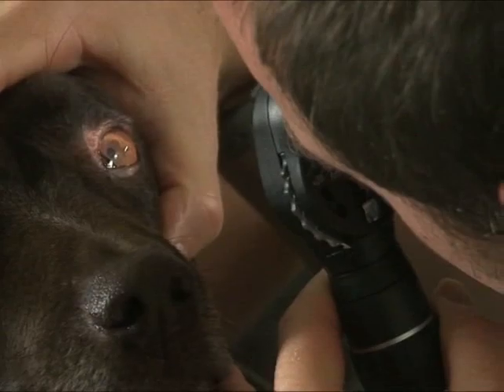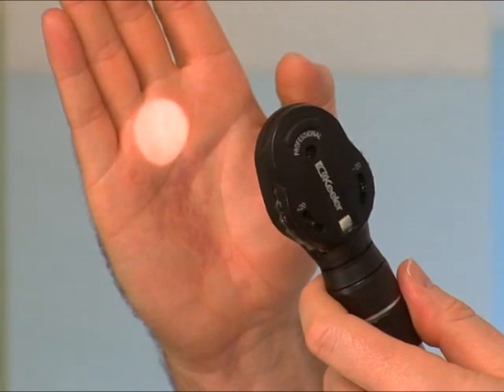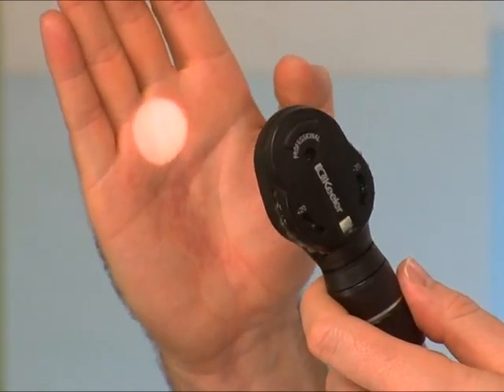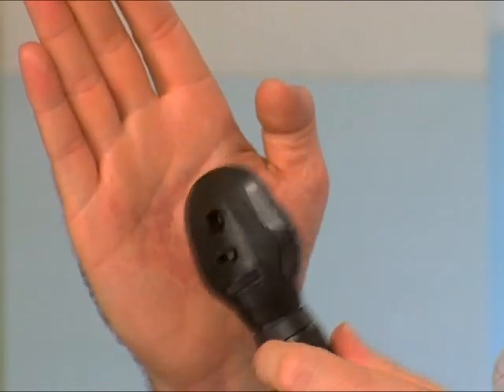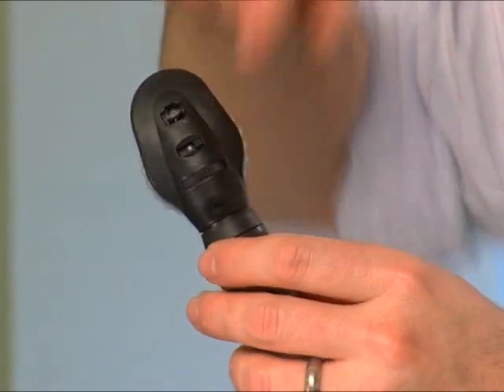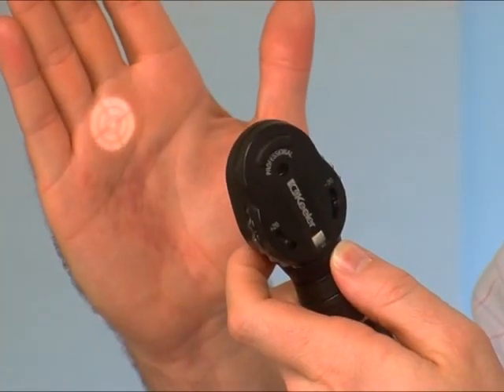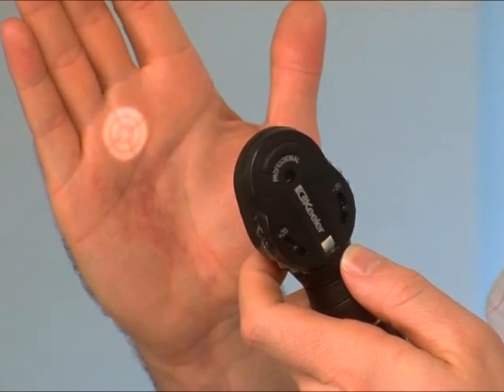The other thing you can change with the ophthalmoscope is the type of beam that is emitted. There's the large white light, and that's by far the most common light source or beam that you'll need. There is the ability to change the type of beam that's emitted by rotating this wheel here. As well as a large circular beam, there will be a variety of smaller beams and various grids. Now, the grids are predominantly for the human world and not particularly relevant to us.